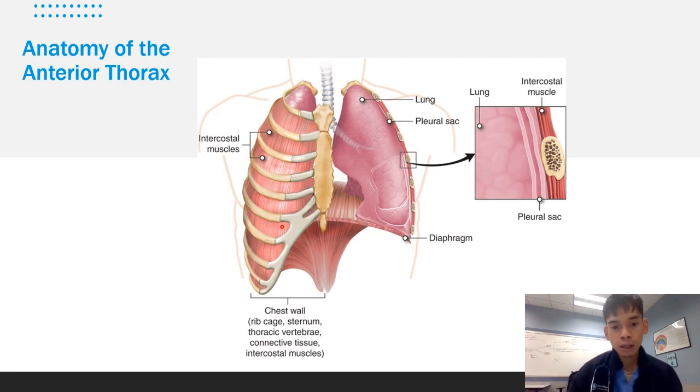The probe placement, in contrast, would be the midclavicular line. So you can imagine a clavicle going right here. You go half that clavicle, and then by textbook, it should be the 3rd or 4th intercostal ribs. So you count your ribs, 1, 2, 3, 4. So between here is your 3rd, and between here is your 4th, okay? So you put the probe here.